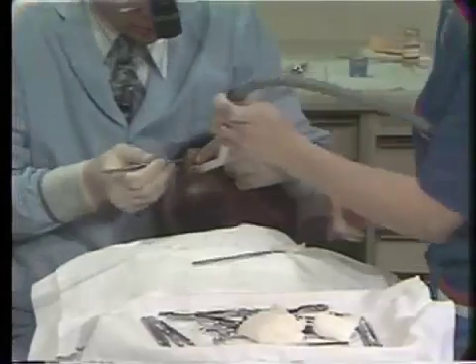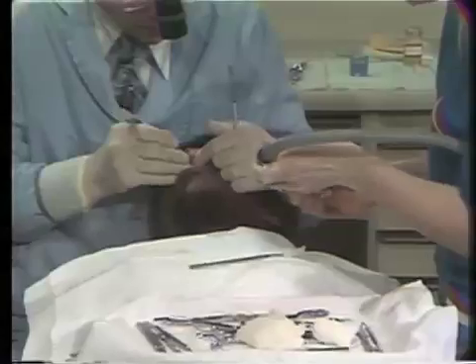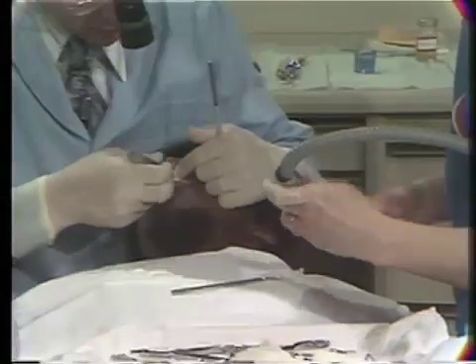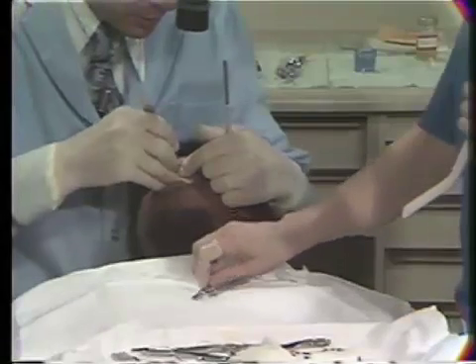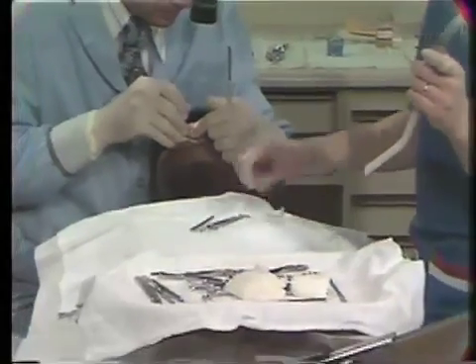Notice how she hands an instrument at the same time she takes one out of my hand. So she has it held in her hand in such a way that she can take the instrument that I have as well as rotate her hand and immediately hand the new instrument that is necessary to assist. Evacuate.